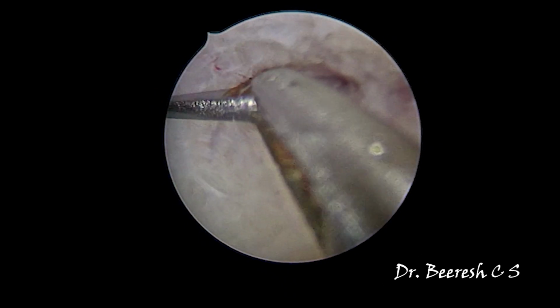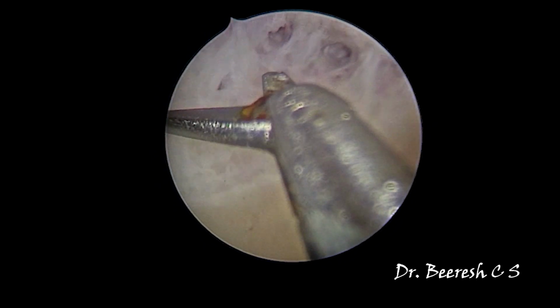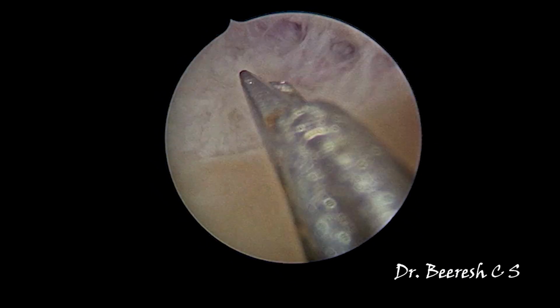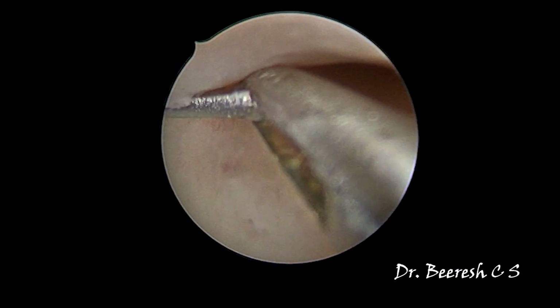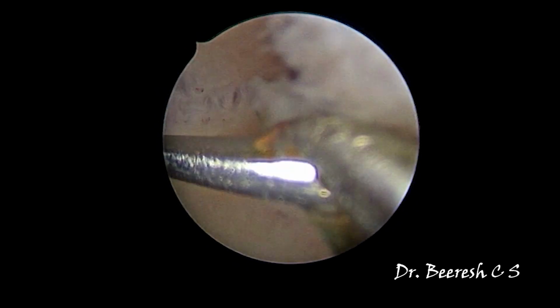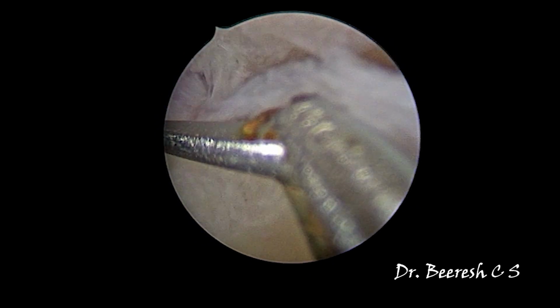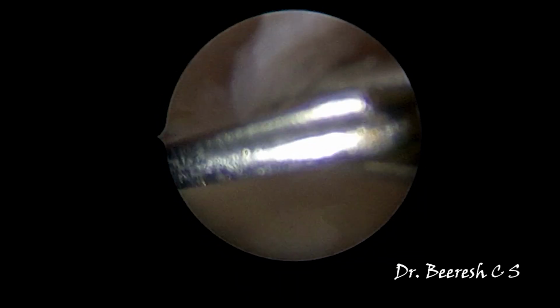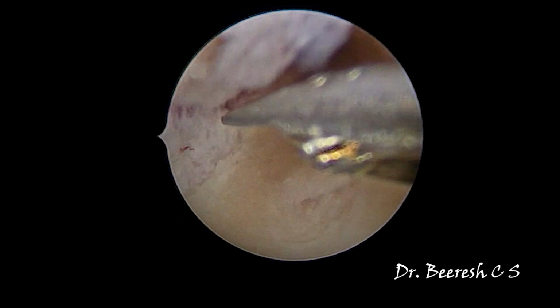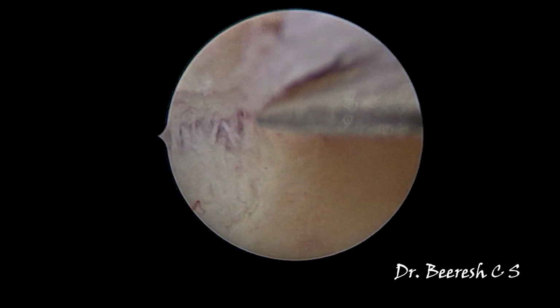So the end point of my dissection here is decided by visual clues. The septum, most of the time being a fibrous component, is pale, and the myometrium, being vascular, is a little pinkish in appearance. This visual appearance guides me in deciding the end point of the septal resection.